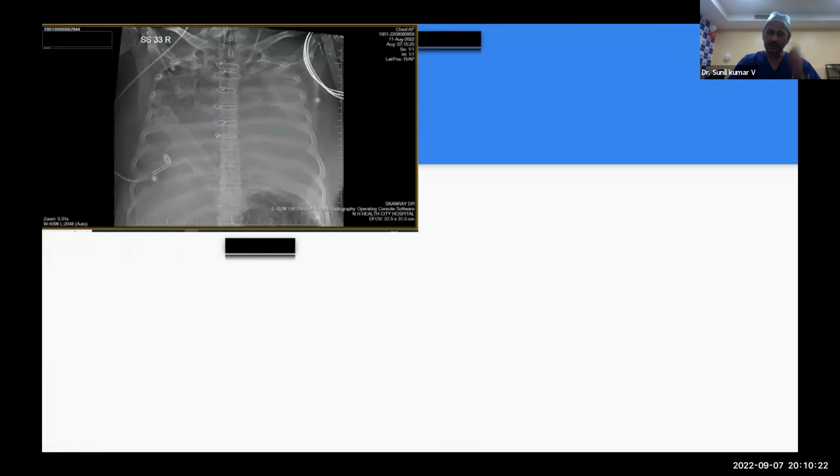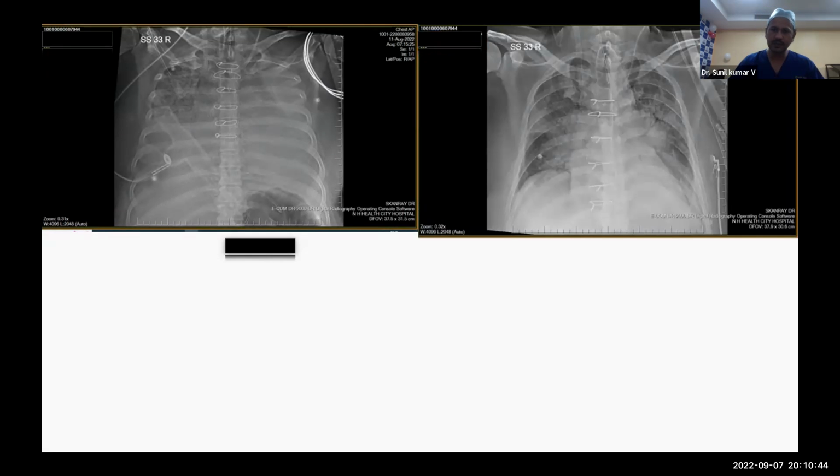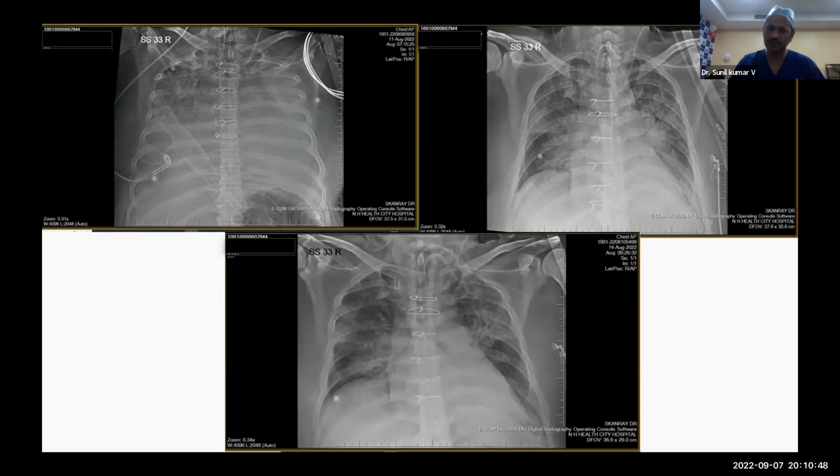So then again, we proned the patient so that the gravity-dependent blood in the lingula can come out. As expected, all the lung fields became whiteout because of the bleeding. So again, we kept doing the bronchoscopy day by day. Within a few days, it recovered. It looks like normal.